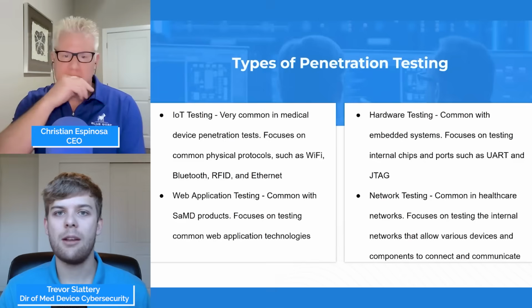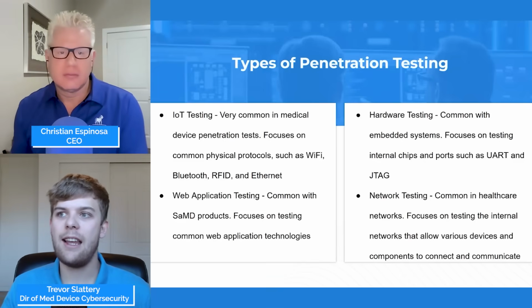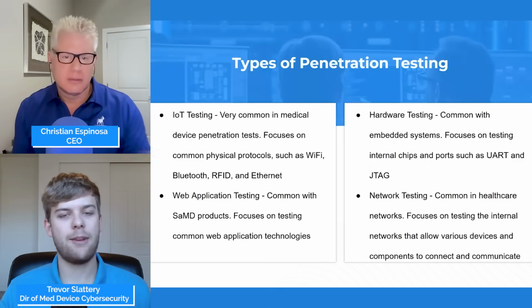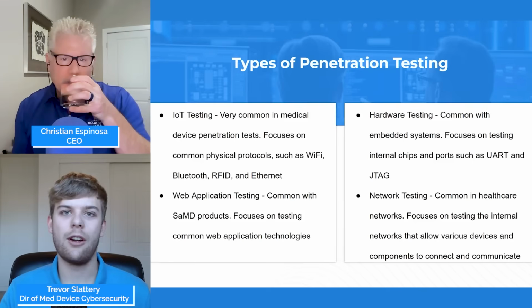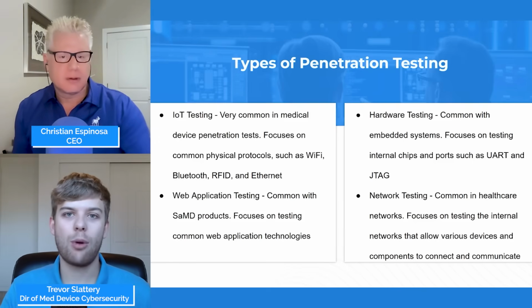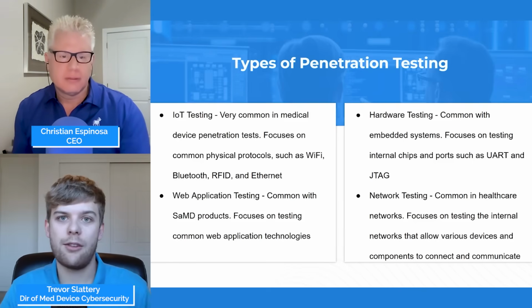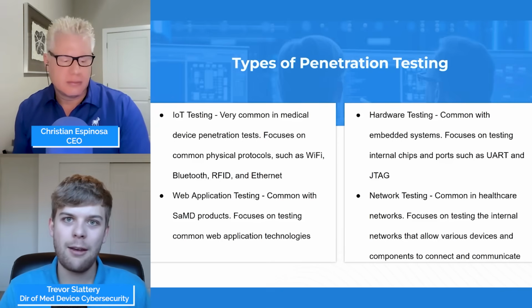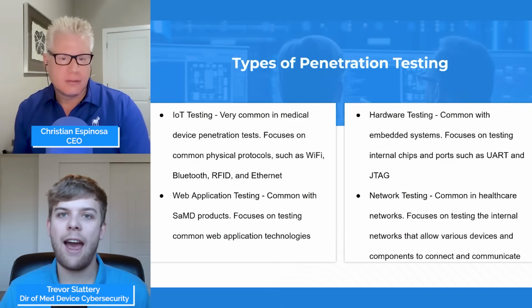Essentially what we're talking about when we say Internet of Things is any smart device, something connecting to the internet. A smart fridge or a thermostat could be an Internet of Things device, or maybe a pacemaker, maybe a patient monitor. It's a pretty broad umbrella, but the testing principles are all going to be the same against these different interfaces. Of course, there are different regulatory requirements per industry, but they're all going to have similar protocols and similar hacking techniques when we're trying to penetration test them.